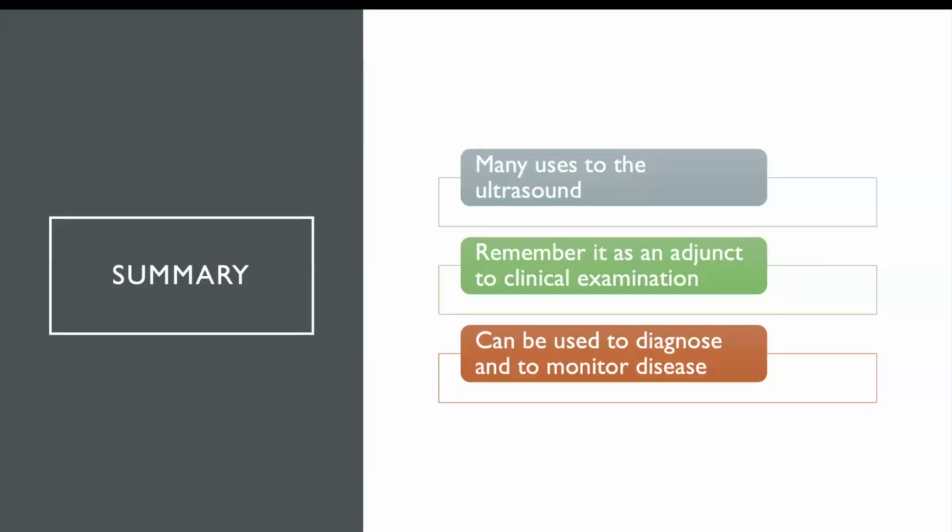So, practice using it in your clinical practice. Consider using it even when you know what the diagnosis is so that you can learn how these things look in real life.